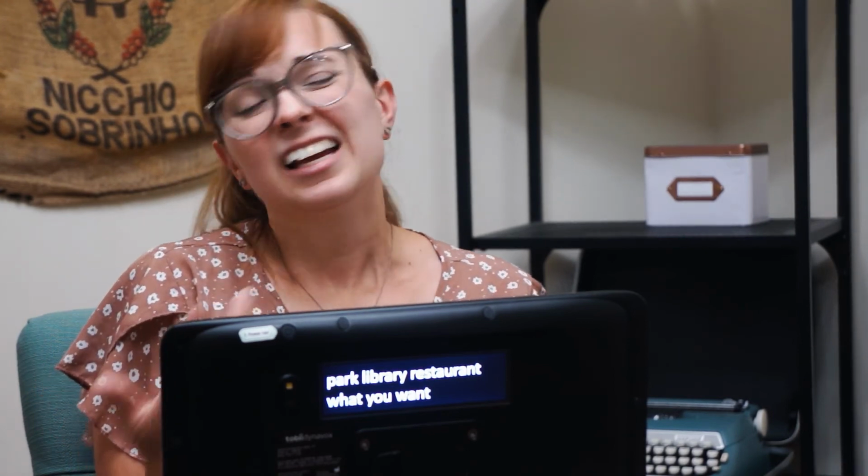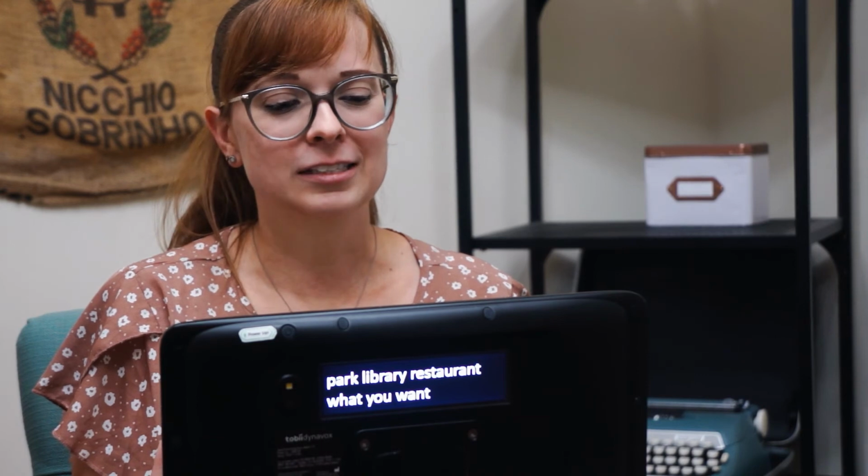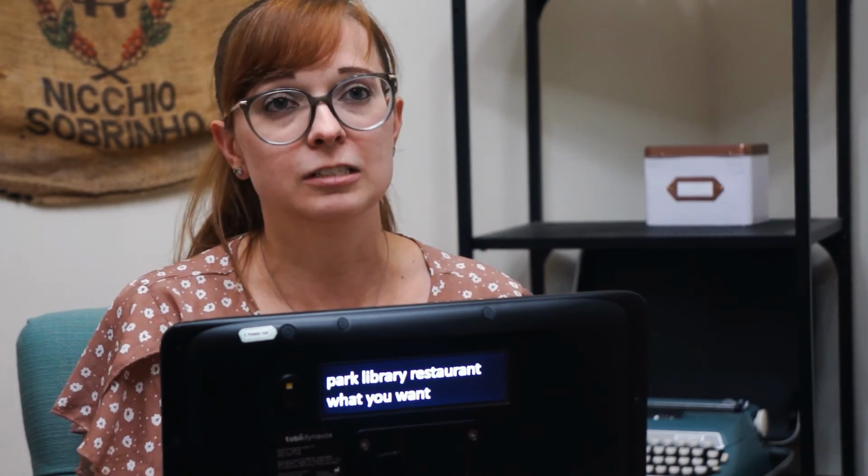If they're in pain or if they need something, if they want to tell you how they're feeling, it's not really fair to ask them to navigate between a bunch of different pages and take that time and that energy to write out every single word. Especially if you have little ones. I have a 4-year-old, and if she is hungry, she's crying, she's on the verge of being totally hangry, I'm not expecting her to look at her device and be like, Mom, please get me some crackers, okay?